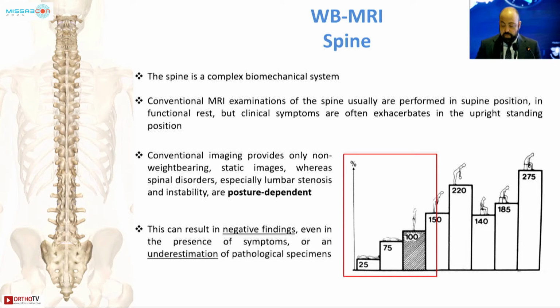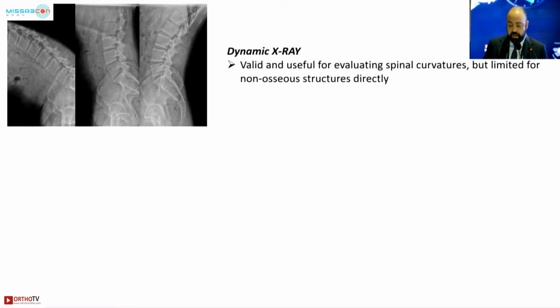We know from the previous speakers the importance of imaging the lumbar spine under load, because in the supine position the spine loads only 25% of the total load that is on the spine in the standing position and in other positions. So it's important to make posture-dependent imaging, because otherwise it can result in negative findings in the presence of symptoms and an underestimation of pathological findings.